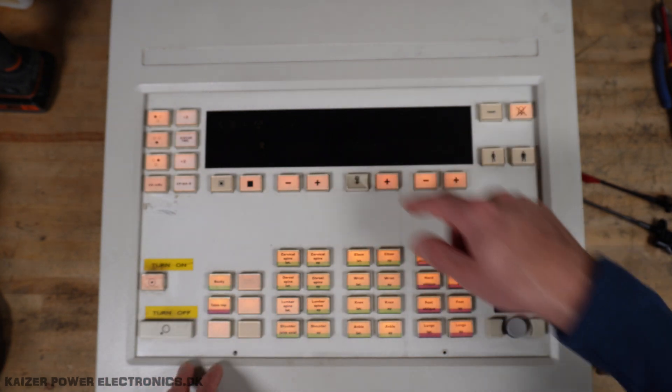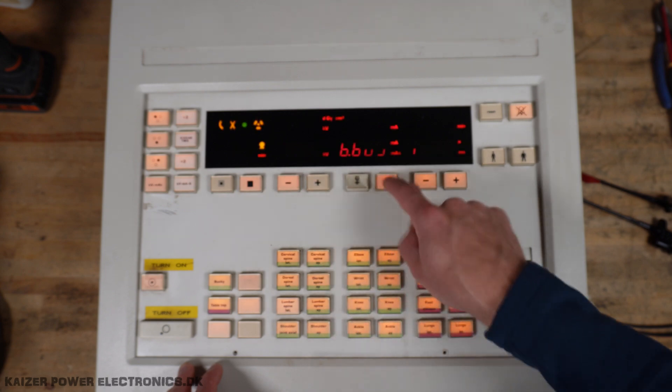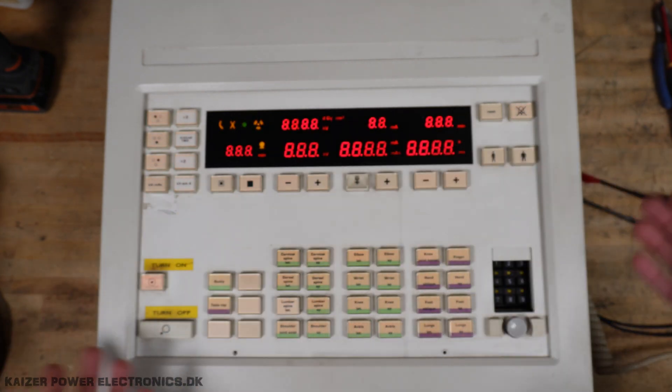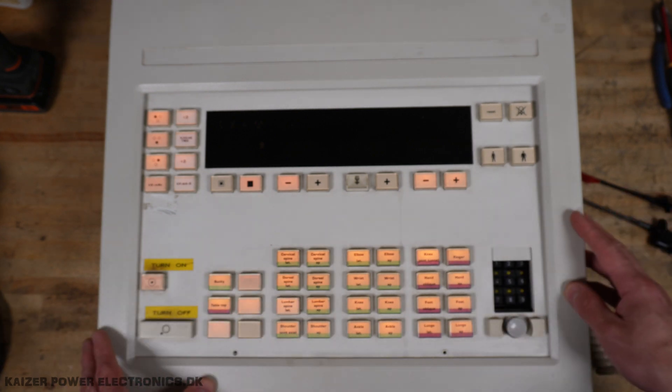And of course, if I turn on the whole LED up here, that also pulls quite a lot of current. But it turns everything else out, then turns it on again. Oh well. Enough for the testing — let's get this taken apart.